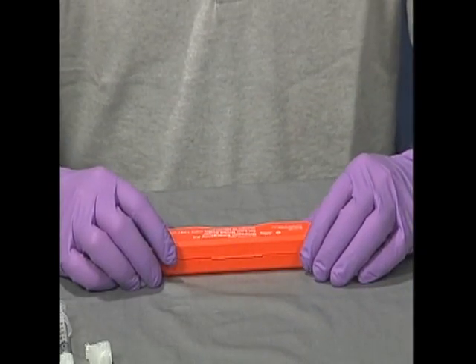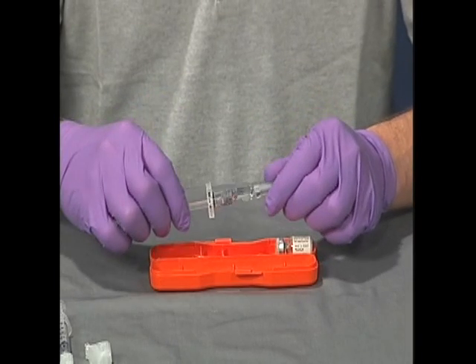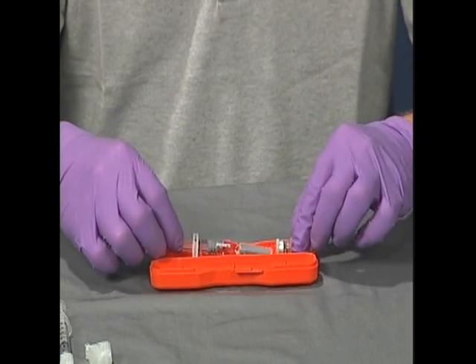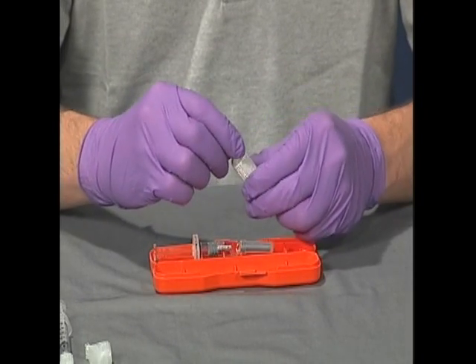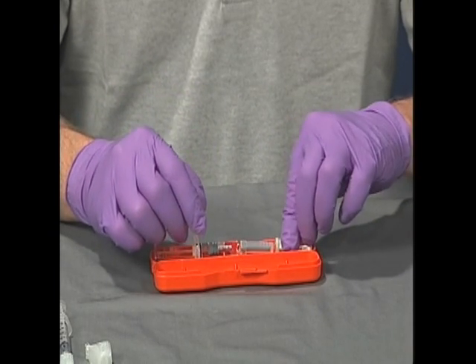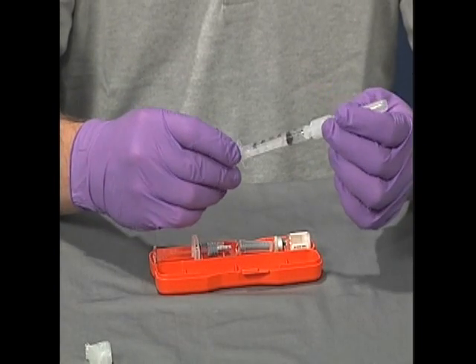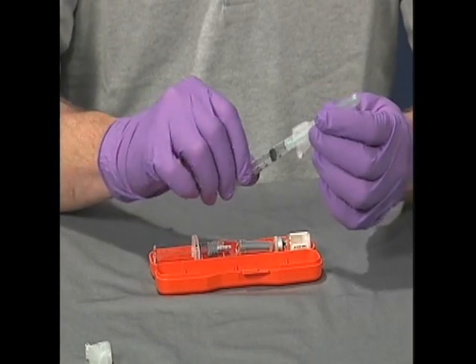When administering medications using a syringe and vial system, inspect the medication to verify the right medication, the right dose, the right expiration date, the right route, and the right patient. Select an appropriate size syringe for the medication to be delivered.